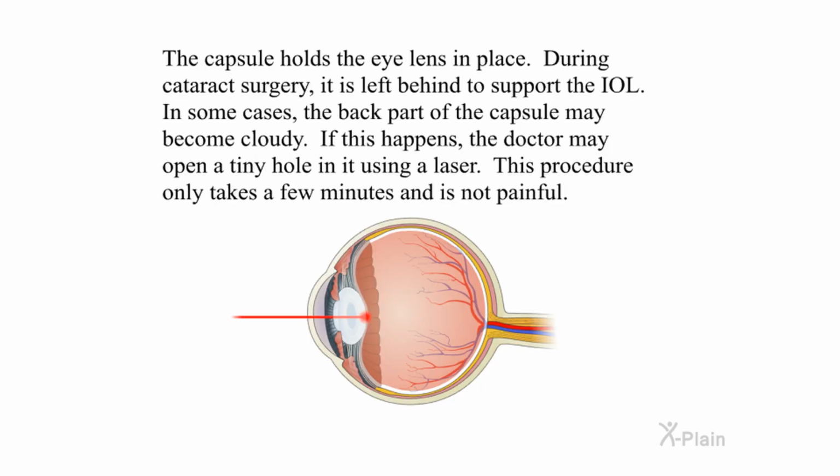The capsule holds the eye lens in place. During cataract surgery, it is left behind to support the IOL. In some cases, the back part of the capsule may become cloudy. If this happens, the doctor may open a tiny hole in it using a laser. This procedure only takes a few minutes and is not painful.